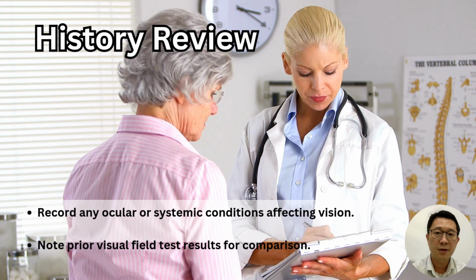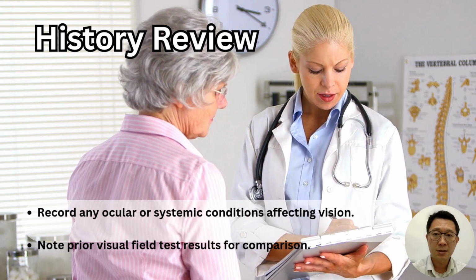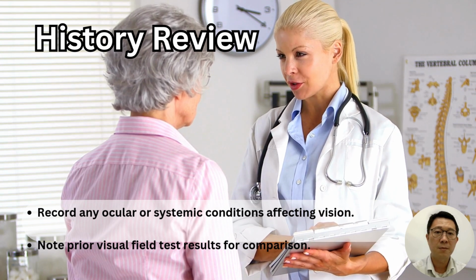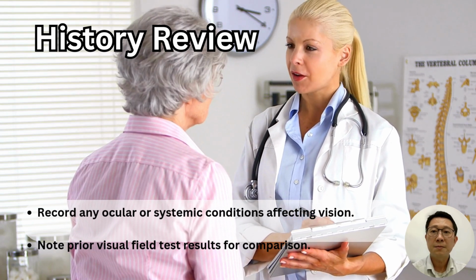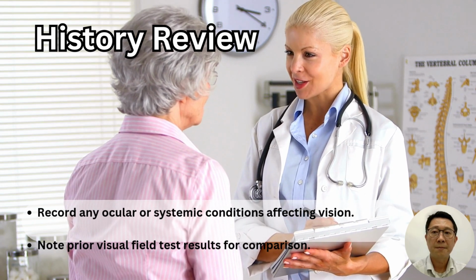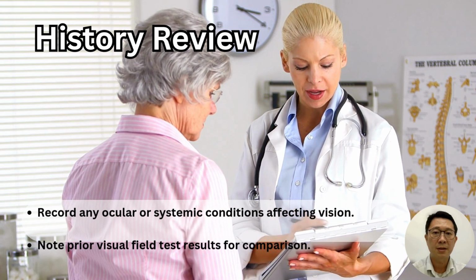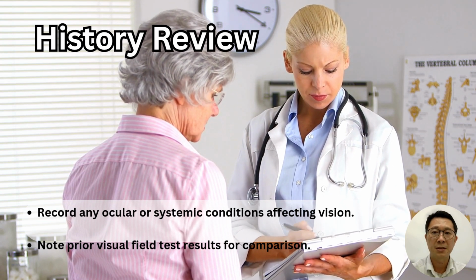This helps the clinician detect changes over time, track disease progression, and make informed decisions about diagnosis, treatment, and follow-up care. By taking a thorough history, we can interpret the test results more accurately and provide better patient management.